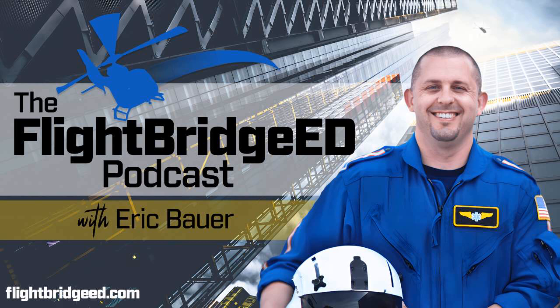All right, and once you do that, you're going to watch your patient. Look at your saturation. If your O2 sat drops a little bit, you're going to increase your PEEP to 8. All right, and you're going to wait again for a few minutes. And so you have a PEEP of 8 and an FiO2 of 50%. Most likely, that's going to maintain great oxygenation. If it doesn't, then you can increase your FiO2 to 60%.